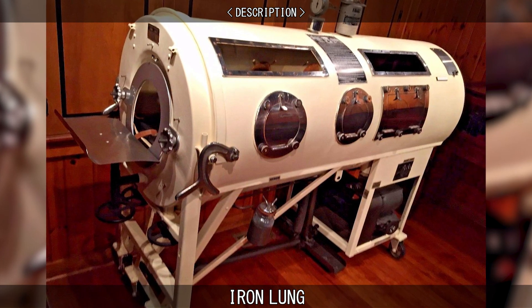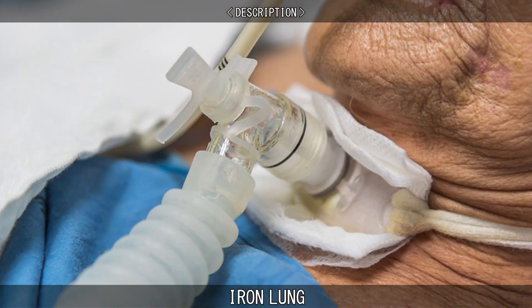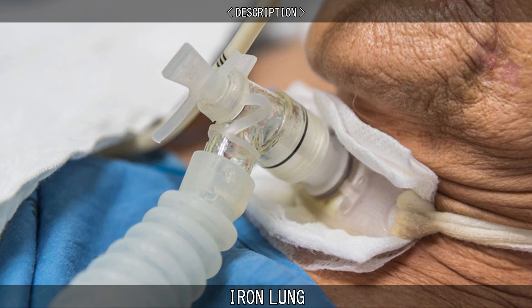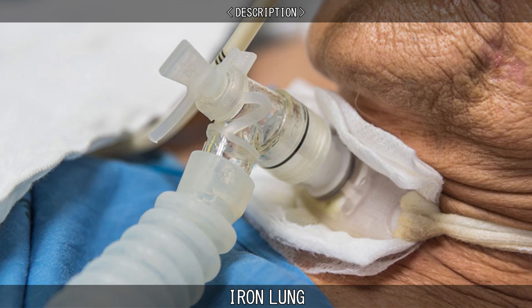The use of iron lungs is largely obsolete in modern medicine as more modern breathing therapies have been developed, and also due to the eradication of polio in most of the world.